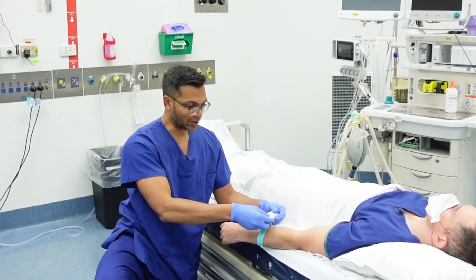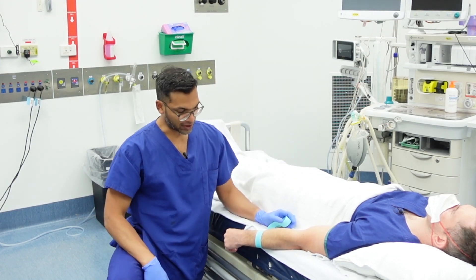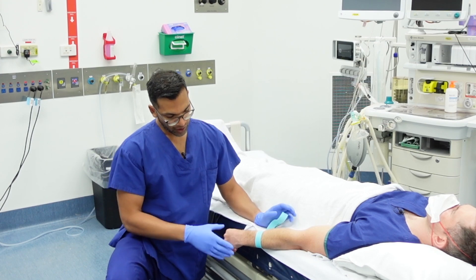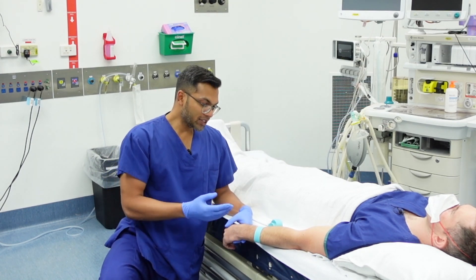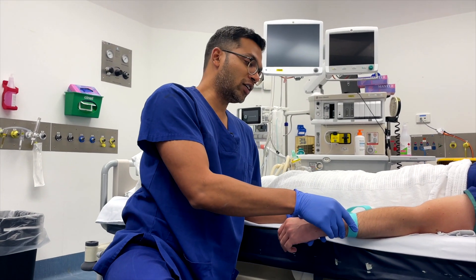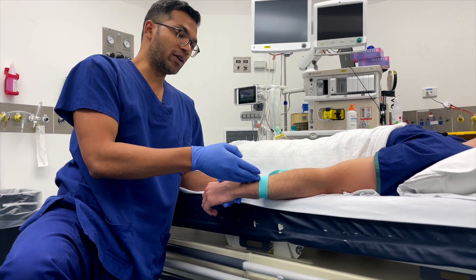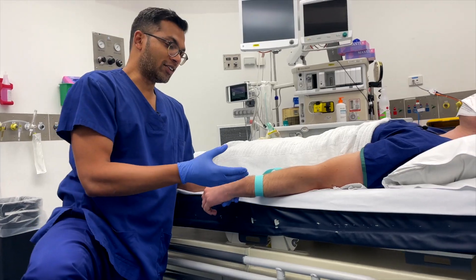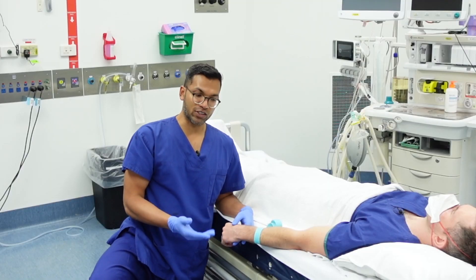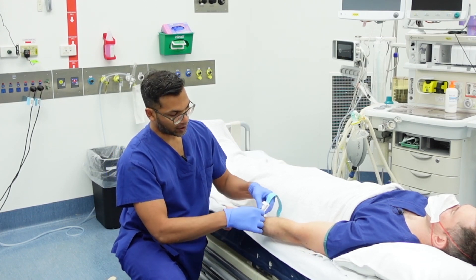You might see someone putting a tourniquet on the forearm, and that's completely fine — you can be absolutely successful doing this. Just know that if the patient has good veins it'll be no problem, but there is a potential issue because there are two bones in the forearm — the radius and ulna — and some veins traverse between those bones and might be uncompressible. So there's a chance you'll still have some venous backflow. Therefore, for most cases I put the tourniquet up around the arm.